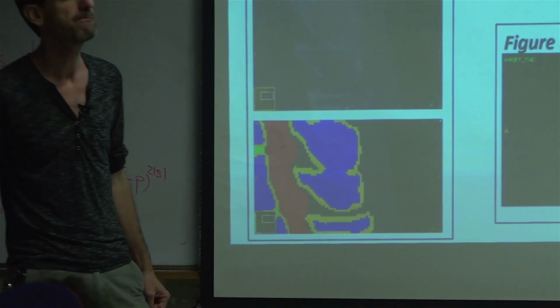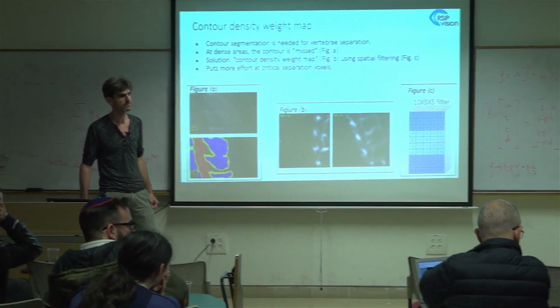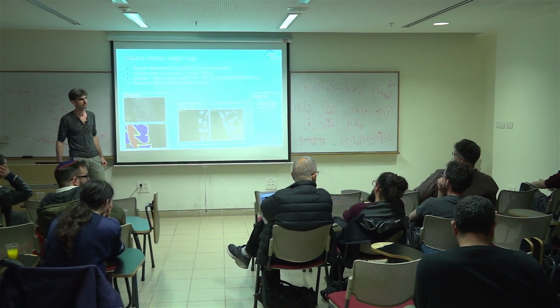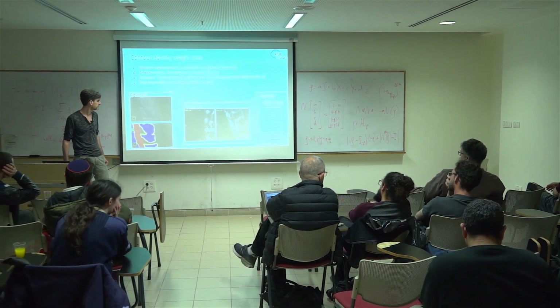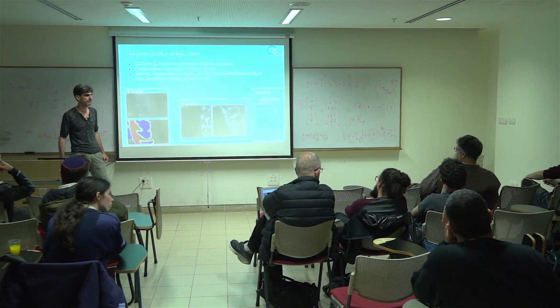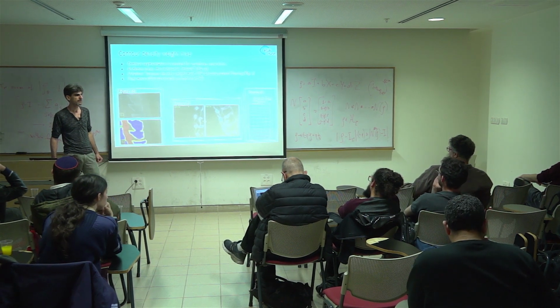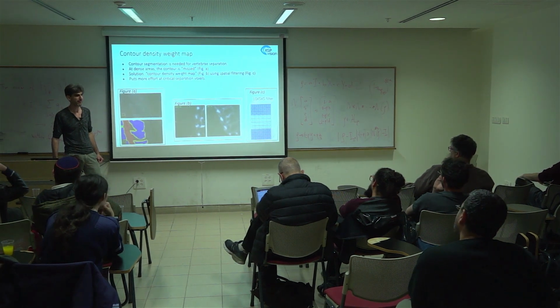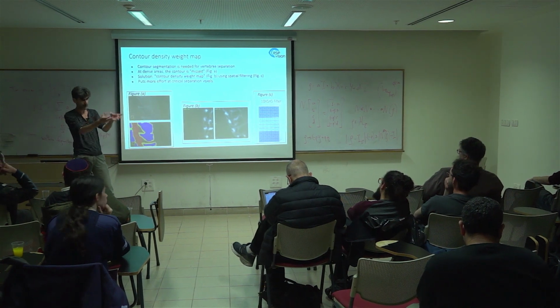Yes, please. Again, I'm going back to the motivation of the segmentation. The motivation is to assist the surgeon while doing the surgery? Yes. Okay, so here, for instance, there are two tissues. One of them is bone, another one is... Spinal canal. Okay, so you actually want to help him navigate to the bone and not hit the spinal canal by mistake. Yes, definitely. You definitely don't want him to hit the spinal canal, and you want him to navigate to specific areas in the bone. Yes. So he needs to see the 3D shape.